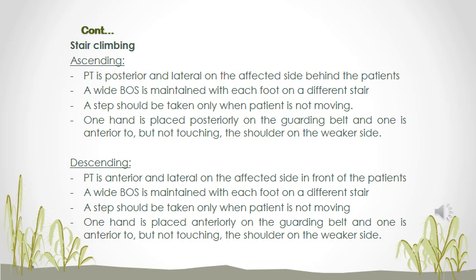When your patient descends, goes down the stairs, you have to be in front, anteriorly and laterally on the affected side. Also maintain a wide base of support, each foot on a different stair. A step should be taken only when the patient is not moving. One hand is placed anteriorly on the guarding belt and one anteriorly, but not touching the shoulder on the weaker side.